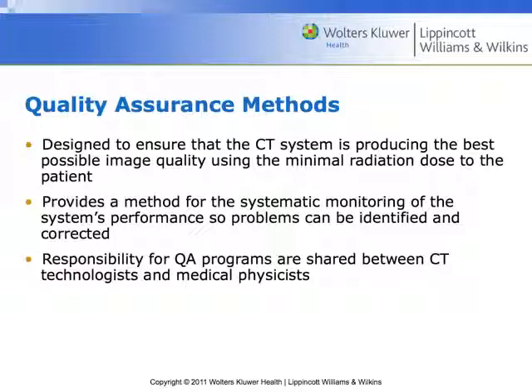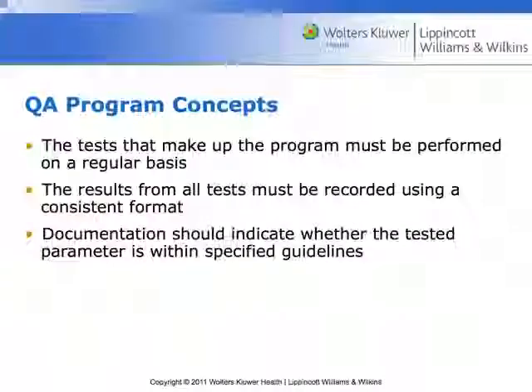The ACR then is going to come in and do yearly QA sessions. And the responsibility is typically shared between CT technologists and their medical physicist. The tests that make up the program need to be performed on a regular basis.